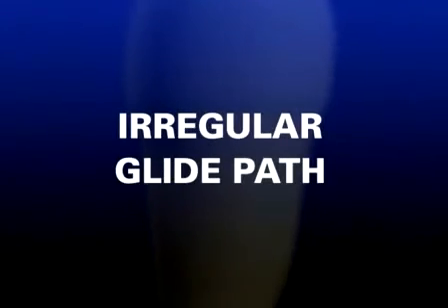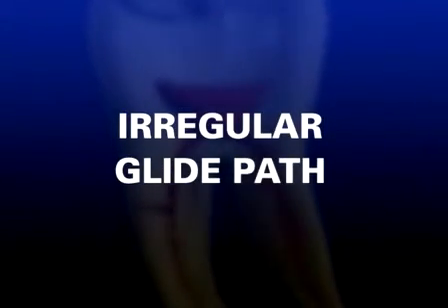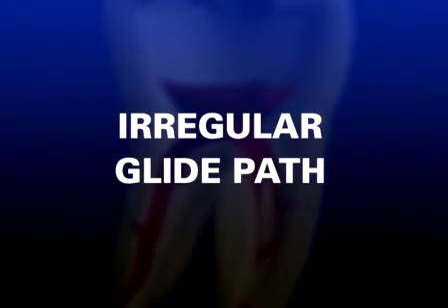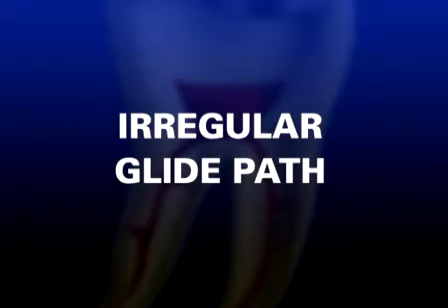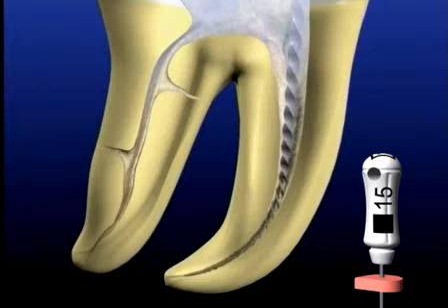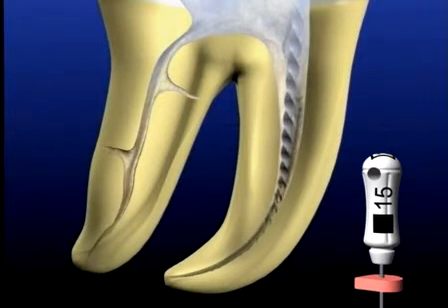The clinician must make a decision whether to finish the apical 1/3 manually or with nickel titanium rotary shaping files. How we do this is we check for the glide path. As we spoke about earlier, when the 15 file is snug and at length, we lift it up and without reciprocating the handle, we push it directly back to the radiographic terminus.